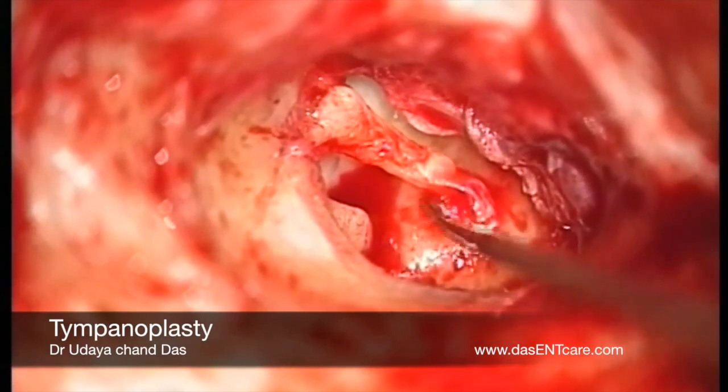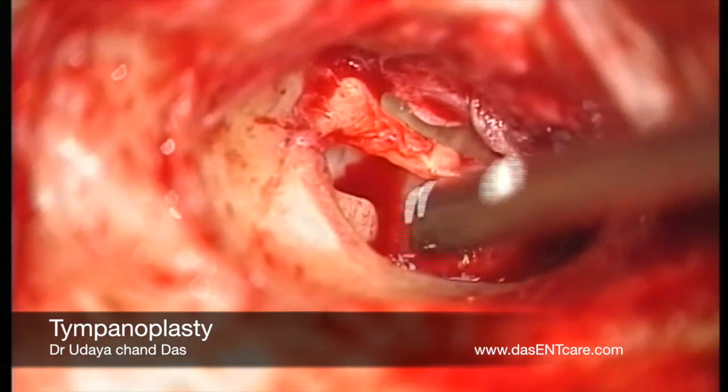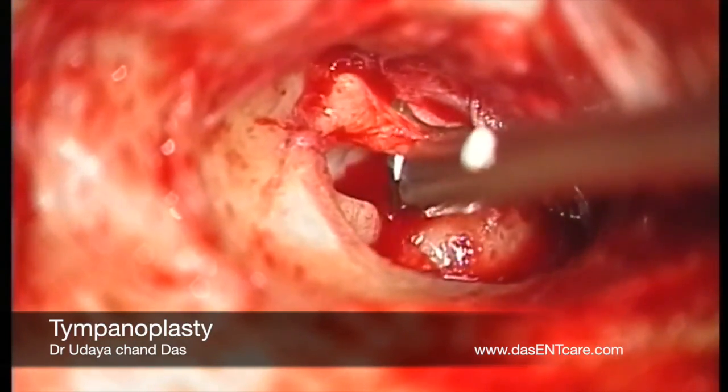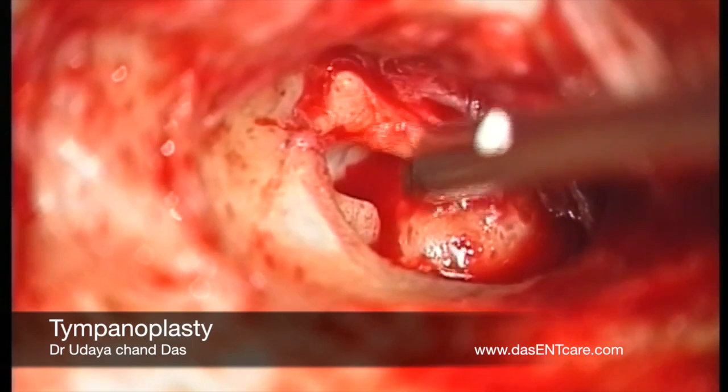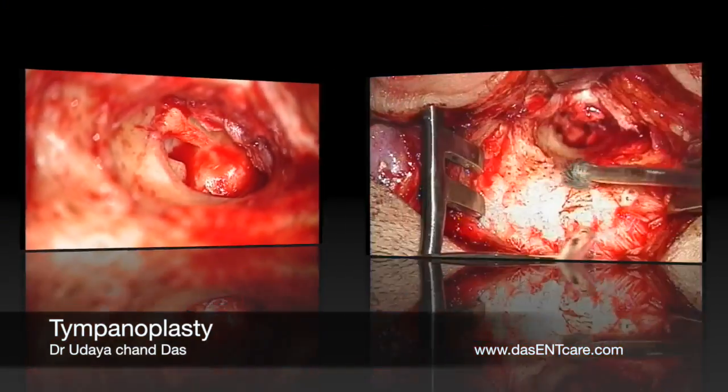Now the ossicular chain movement is confirmed. The handle of the malleus in this case is touching the promontory. Hence a malleus nipper is used to nip a part of the handle — the tip of the handle of the malleus.